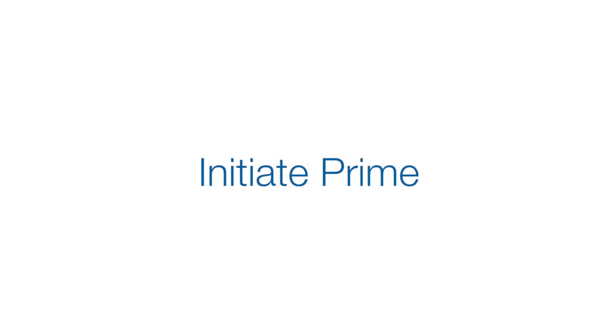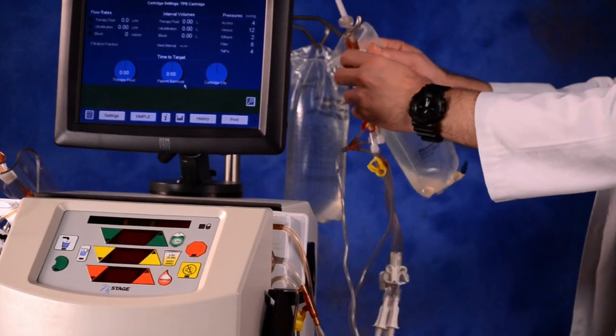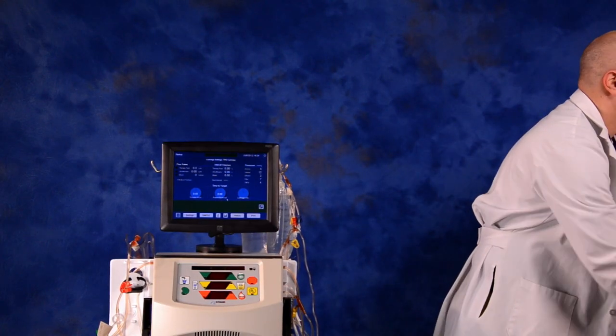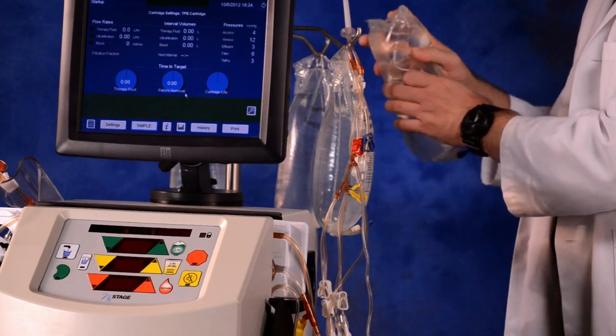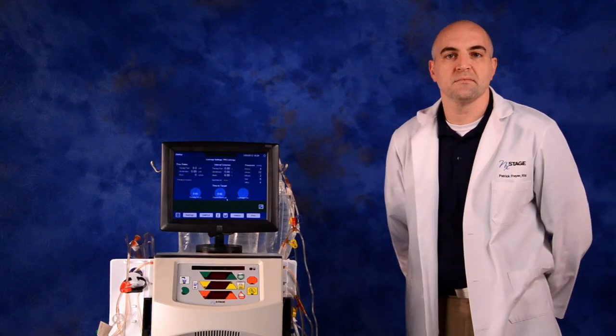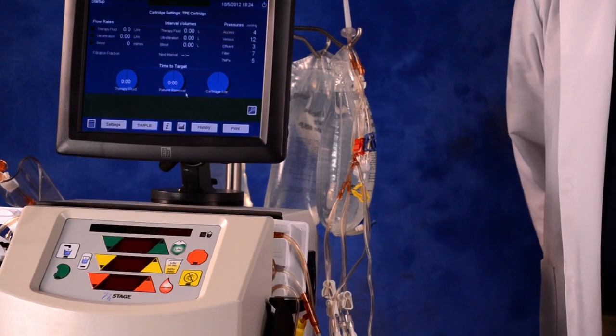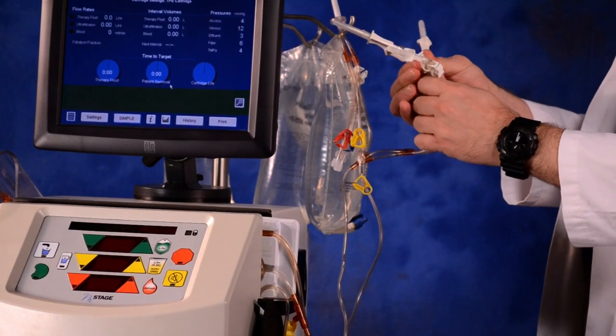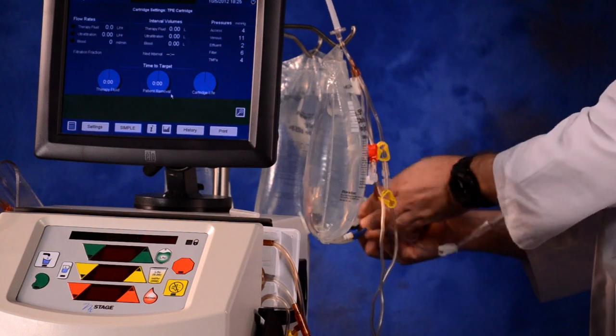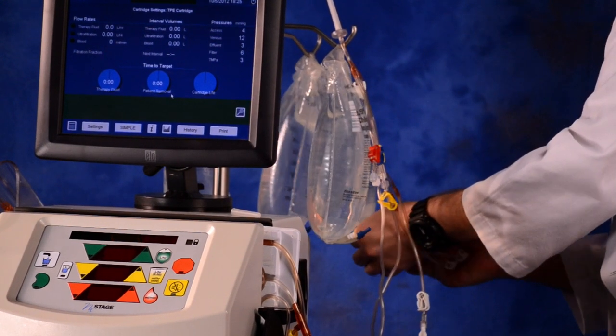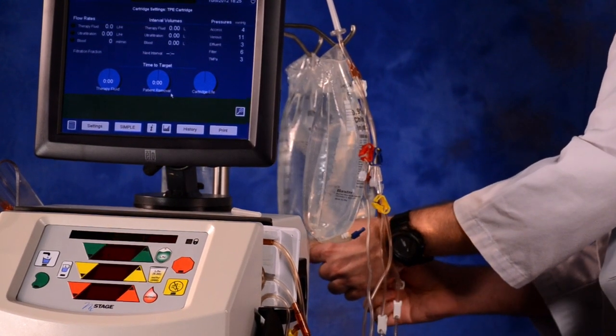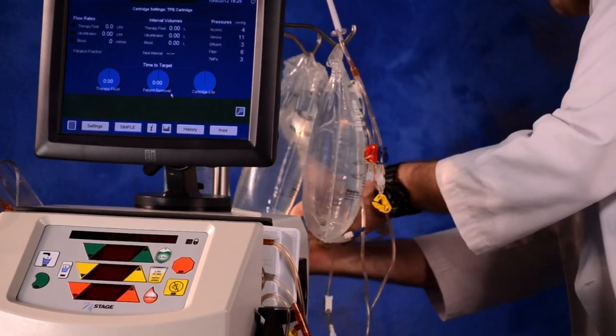We will continue with initiate prime. Hang a one liter bag of normal saline. Hang an additional two to four one liter bags of normal saline on the IV pole. The third and fourth bag hung will give you approximately 30 to 45 minutes of total recirculation time without exhausting the fluid. Clamp all four white clamps on the priming spikes. Insert the priming spikes into the additional one liter bags of normal saline and keep the white clamps closed. Insert the recirculation spike into the one liter of normal saline until the saline bag is flush with the disc on the spike.